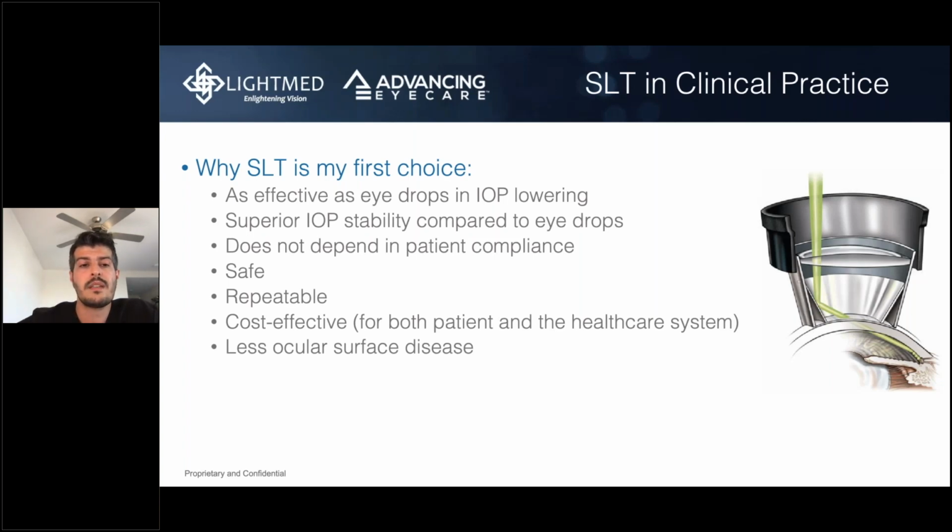But then in between the visits is where the pressure is not controlled, and that's probably why these patients ended up needing more surgeries than the SLT group. So the IOP stability is superior with SLT. It doesn't depend on patient compliance. You don't have to worry about it.